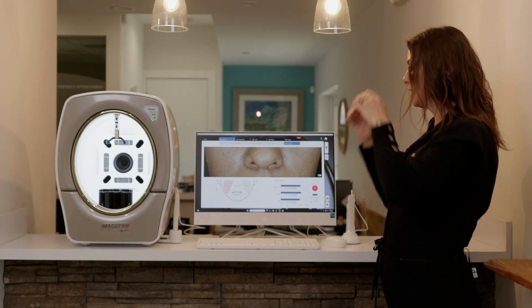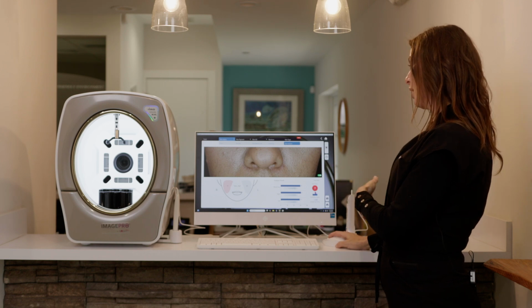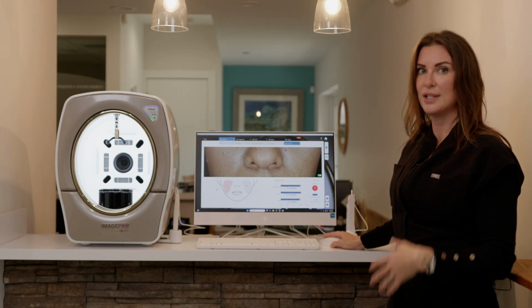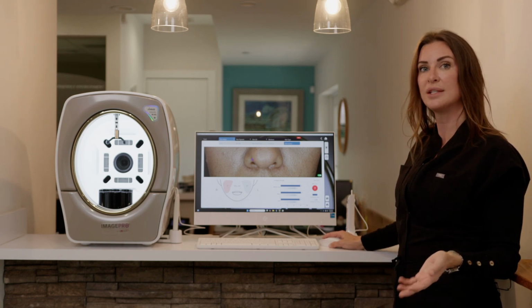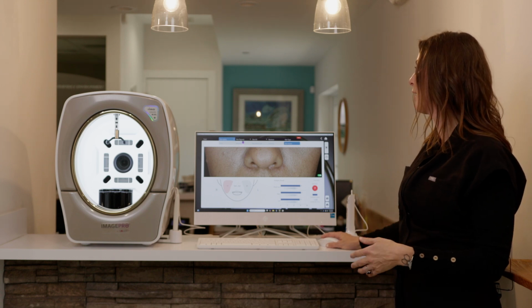Skin texture. So this basically just highlights the skin texture. She's actually 7 worse off than those of her average age group. Things like resurfacing, RF microneedling are all things that are going to help with skin texture. Also, your hydrodermabrasion, your Cytopeel treatments are going to help with that.